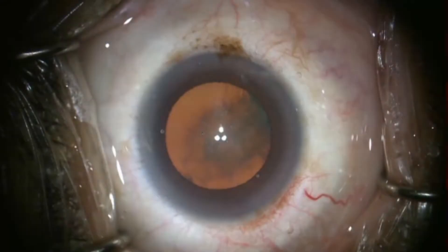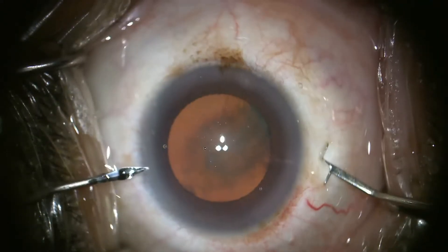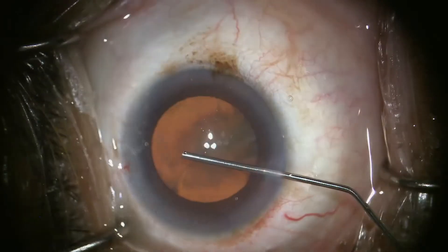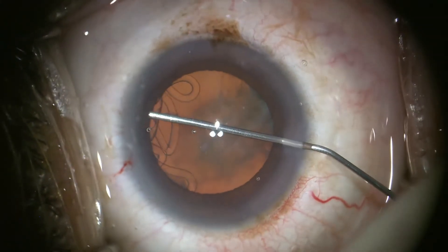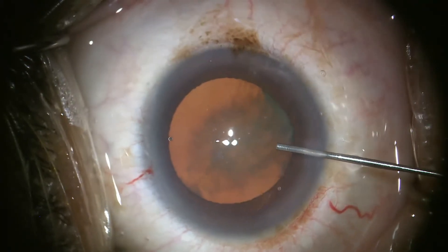The technique works well for dense to extremely dense cataracts. After making 23-gauge paracentesis openings, I inject a lido-phenylephrine mix for comfort and dilation, followed by a dispersive OVD starting from the far side to optimize the view and the fill.